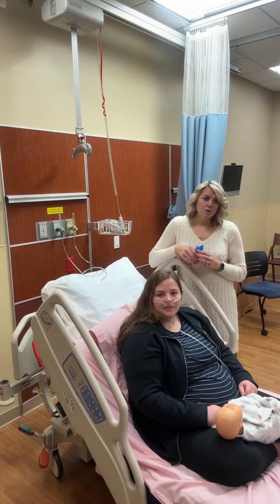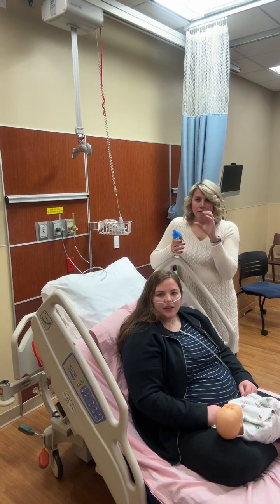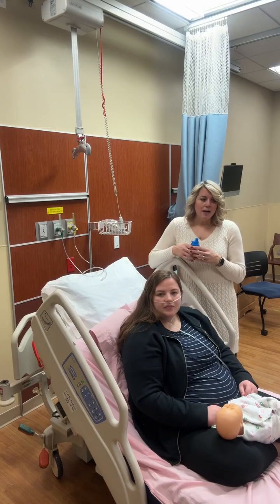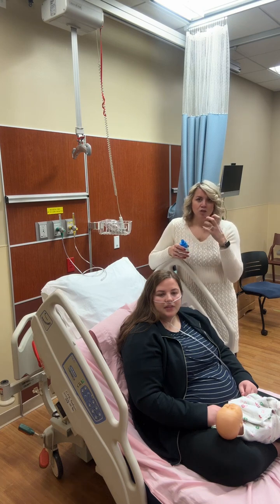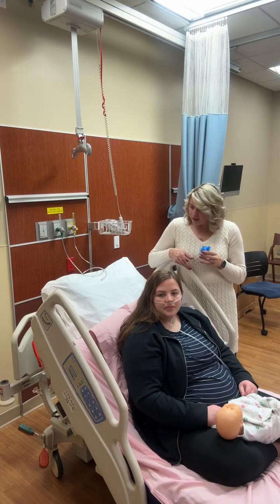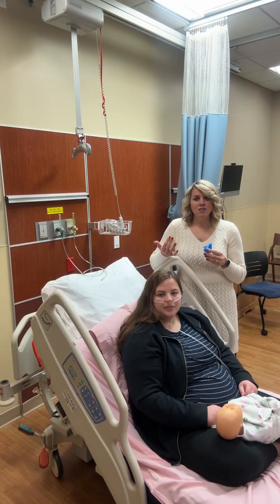All right, and so sometimes if the patient cannot hold the mouthpiece, if they can't keep a seal around the mouthpiece, a mask is appropriate. If their level of consciousness is not well enough to be aware of what they're doing or follow directions, a mask is also something that we can do. So with the mask, everything is pretty much the same.